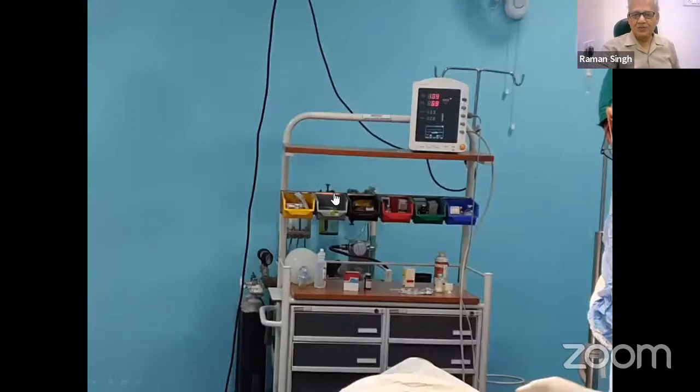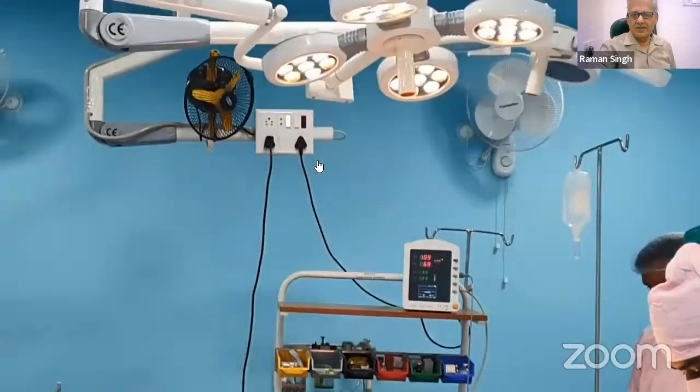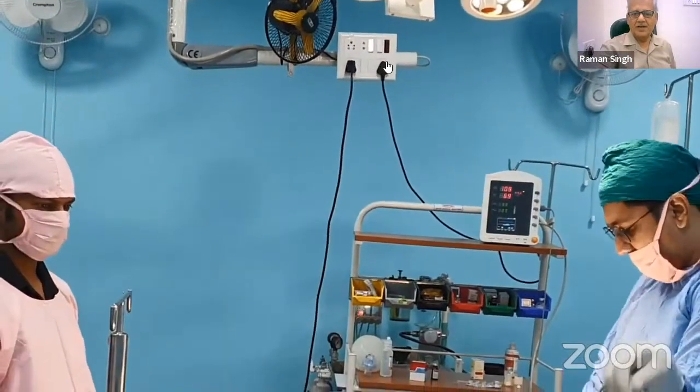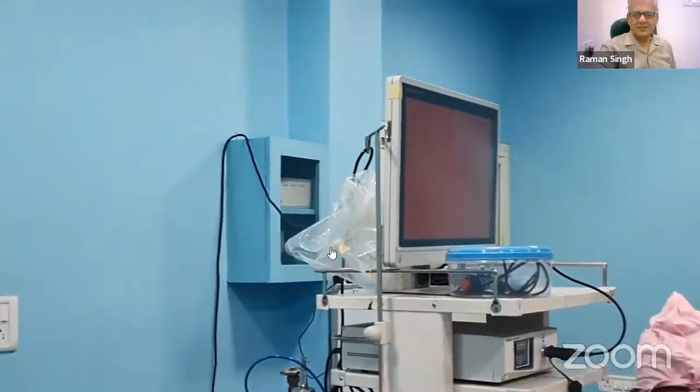Here I will show two laparoscopic surgeries. One was done by my student. This first laparoscopic surgery is being done by my student. This is the operation theater. This is the LED source. You see the cables are attached from outside. This is the monitor.